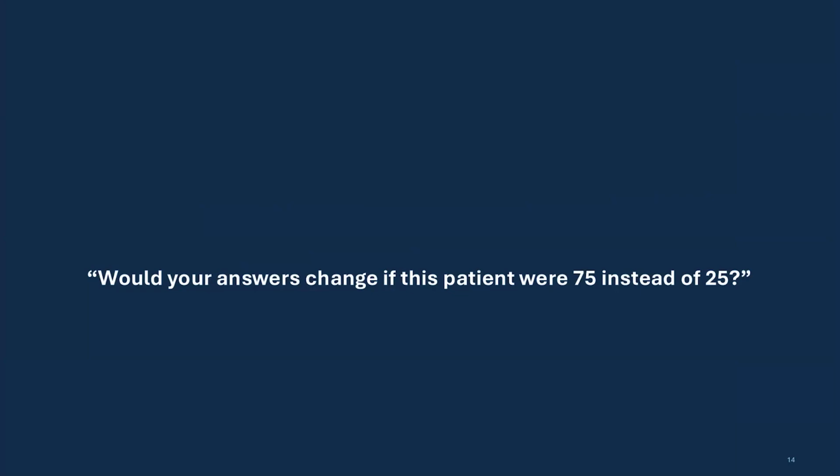Clinically, in this patient, repeat the question please, doctor. It is a 25-year-old female patient, pregnant, and we discovered a complete heart block with sinus rhythm, and we implanted a dual chamber pacemaker.